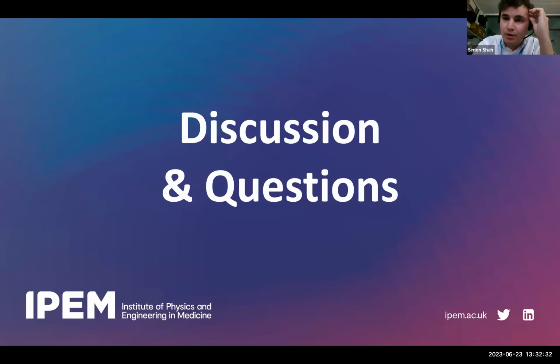But you'll get blurring for Deep Resolve Boost and Gain, because it's a denoising algorithm. Unfortunately, I can't see Sam on this call. But I do remember him talking about it at the presentation, because a lot of this process, as we're learning, relies on radiologists' feedback for the quality of images that they want. One of the things I found quite interesting about his talk was that, from a medical physics point of view, we can get images that we suspect are high quality and really good for diagnosis, but radiologists don't necessarily want smooth images, or they have a different quality metric than we may have as medical physicists. Apologies, we can't answer that for you, Martin, but you can definitely feed back to Sam, and I think he'll be willing to talk to you about that.